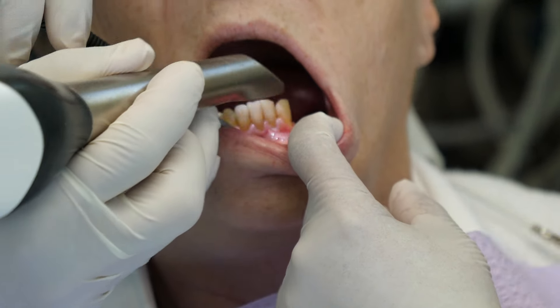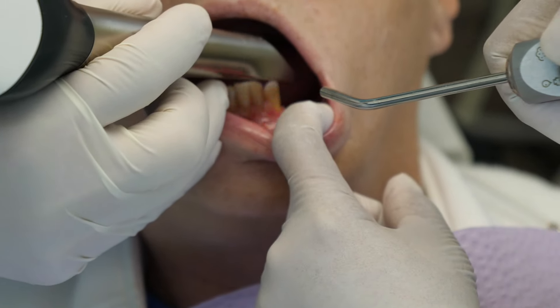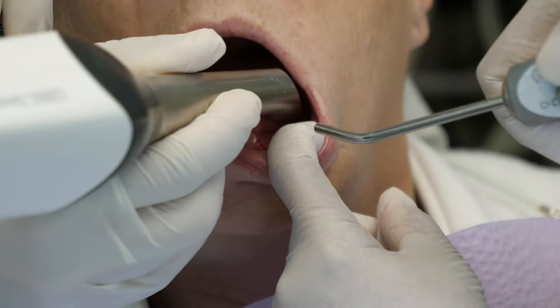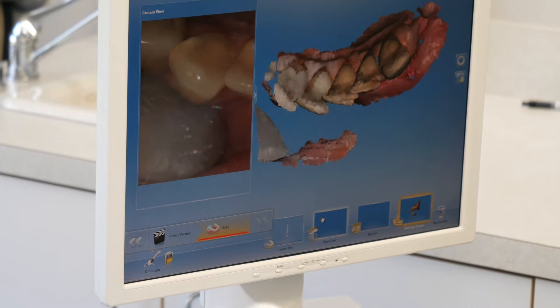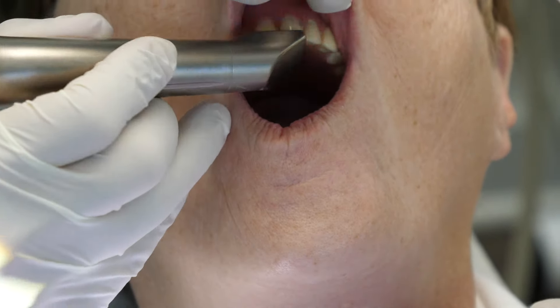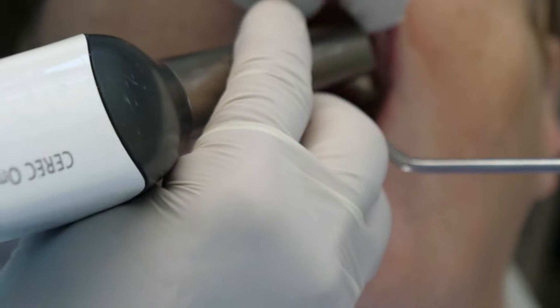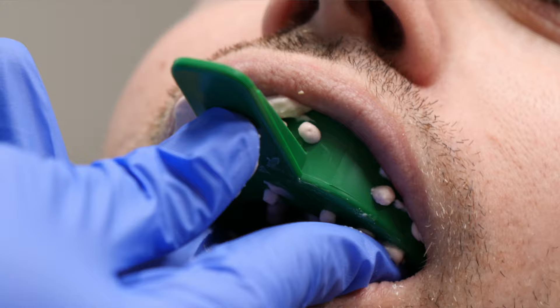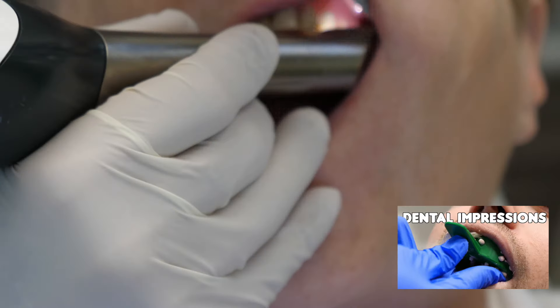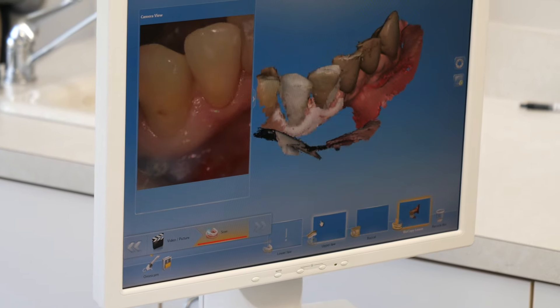Since this patient has a lower partial denture, the dentist is choosing to take a scan of the patient's original dentition before it's prepped and crowned, so they can make an identical crown shape so the partial denture can fit. They may also take a scan of the upper teeth to have an impression for the occlusion, also known as the bite. If the office does not have a digital scanner like you're seeing here, this part will be a lot more goopy with impression material. These digital impressions are replacing the old-school goopy impressions.